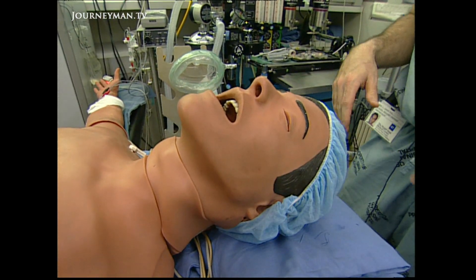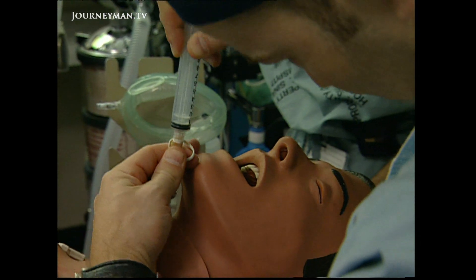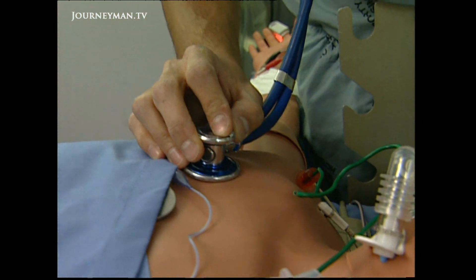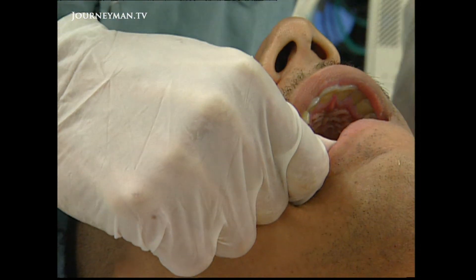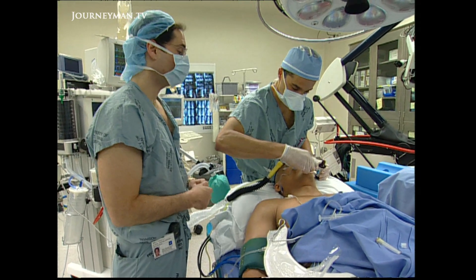The use of a simulator is revolutionary. In the past, we've always relied on patient interaction for our learning. In the practice of emergency medicine and anesthesiology, bad things happen very quickly. You can't use those patient interactions to actually teach effectively. It would be malpractice to allow a resident in training to practice on someone who would have an untoward event if not cared for properly.